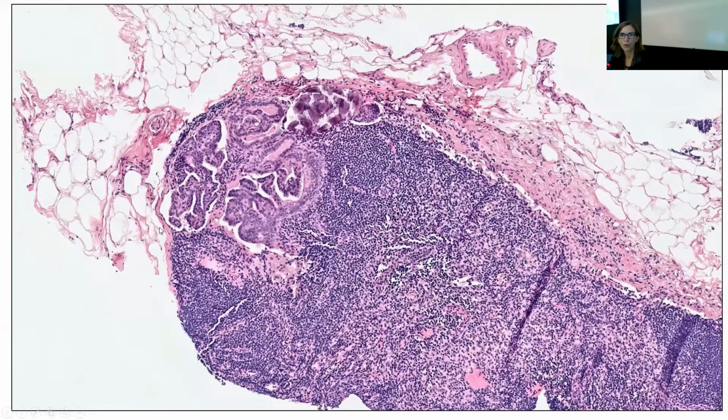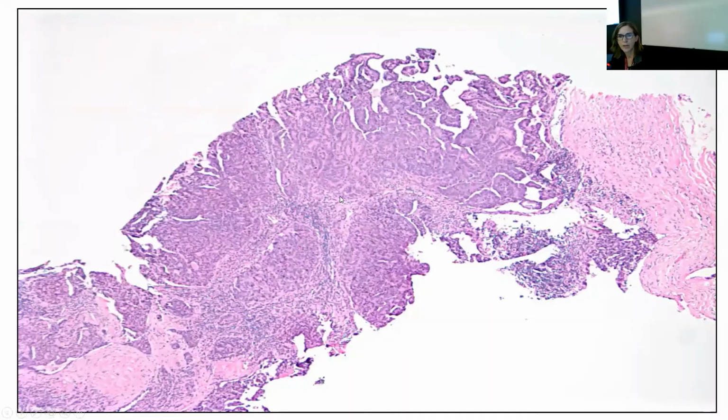And actually what we did in this particular patient was WT1; this slide stained with WT1. We informed the oncologist or the caregiver, and the patient was worked up. So this was primary presentation of serous carcinoma of the peritoneum.